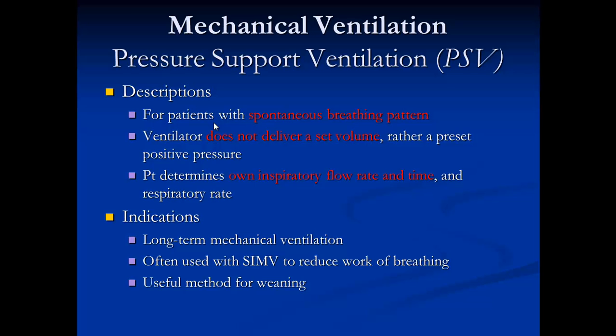Patients that have cerebral palsy, or spinal cord injury that you cannot extubate, you could keep them in SIMV with pressure support. And remember, it's used for weaning mode. It's not used by itself. Pressure support is a factor that is added to either CPAP or SIMV or IMV.